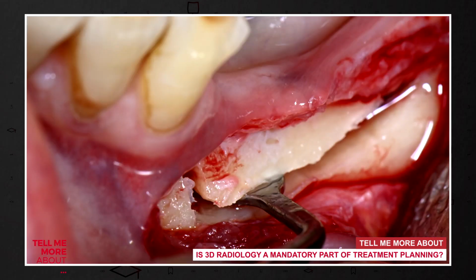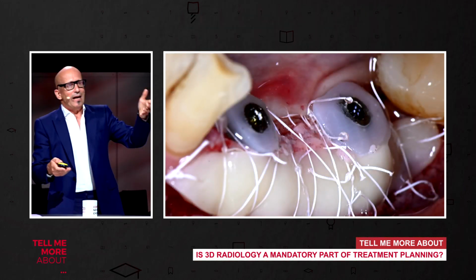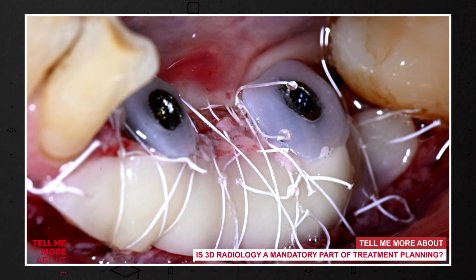And then we can do this kind of treatment. This is a sandwich technique, or you call it a distraction osteogenesis in one surgery. You move the bone up, you bring the bone in between, and then you let it heal. And you wait 3 months, and the bone is there. And after 3 months, you do that, what you see here.